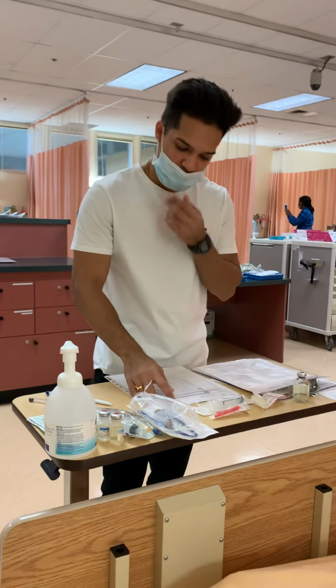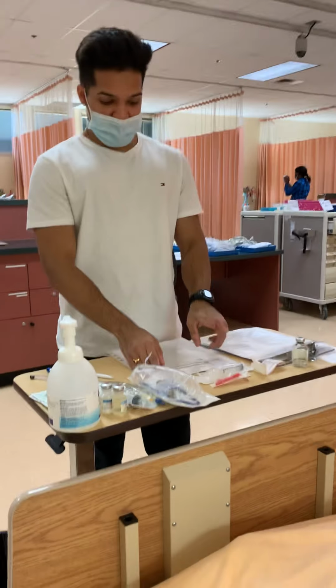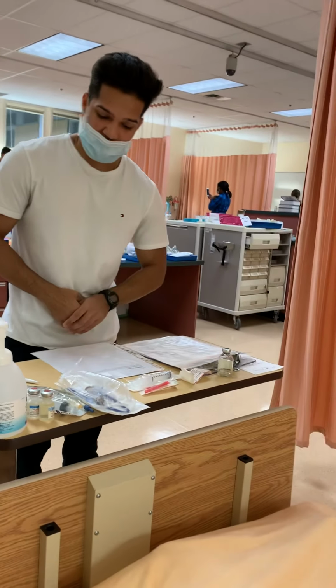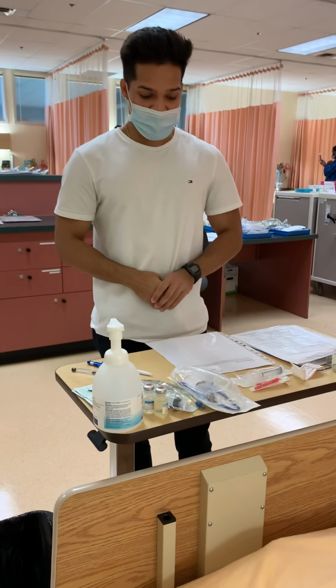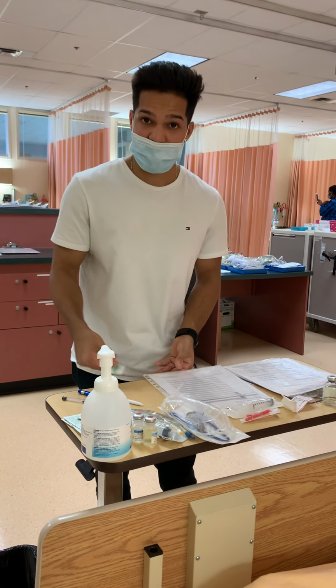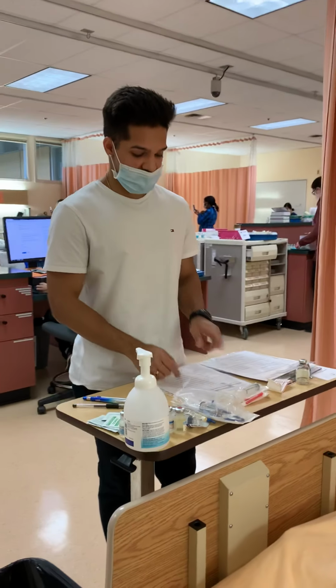Today we're going to be caring for Ms. Wrightson. Her FIN is 1, 2, 3, 4, 5, 6, 7, 8, 9. She has no known allergies, and she is currently admitted to the hospital because her cat scratched her on her left arm, and it is increasingly getting sore and red, so therefore she has cellulitis. The medication we're giving today is cloxacillin, 1 gram IV every 6 hours.